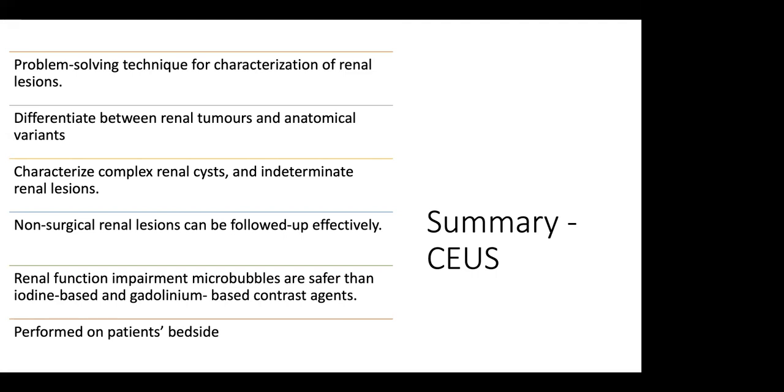And this is one limitation, that the person performing the ultrasound can see everything in real time, versus the static images that they provide. But now there is a changing practice, and all of the ultrasound machines have a small capability of making a cine of the ultrasound examination.